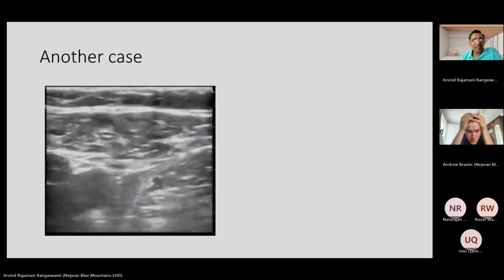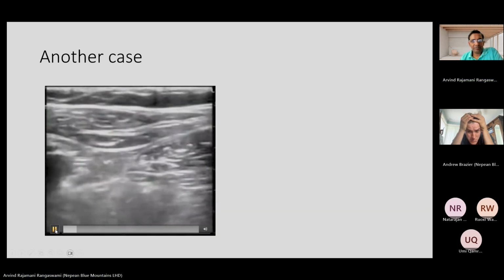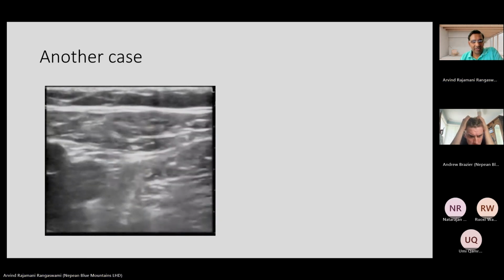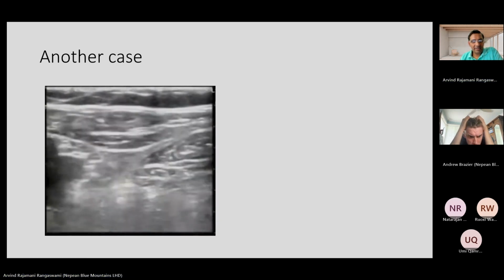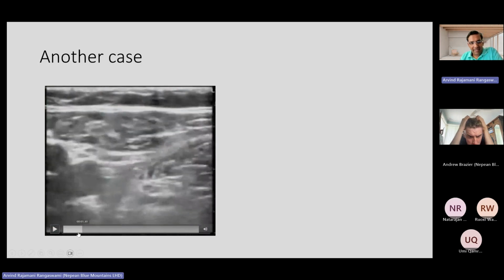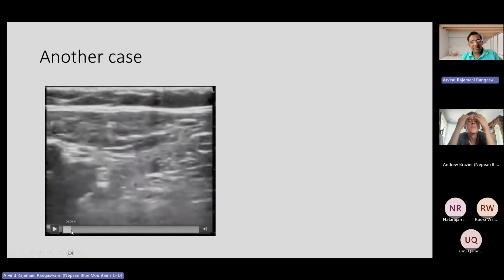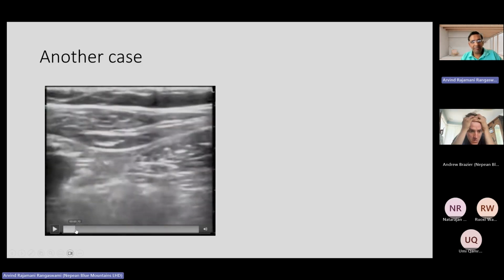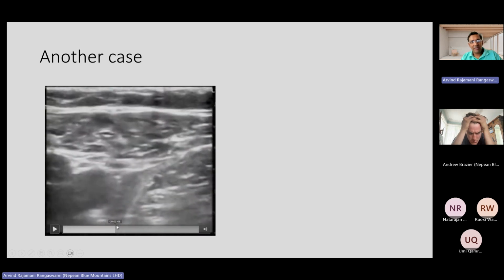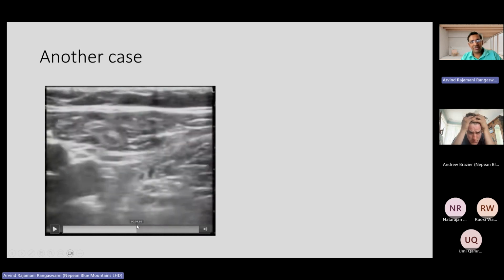Okay. And then what's happening here? The reason I'm pointing this out is because this person actually mistook the superficial vein here as their object of interest, and they said that structure is getting fully compressed, and therefore there is no DVT. So they mistook the superficial structure.